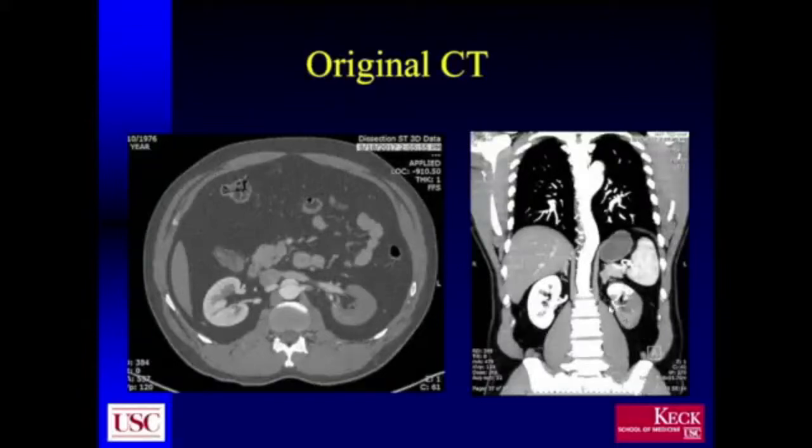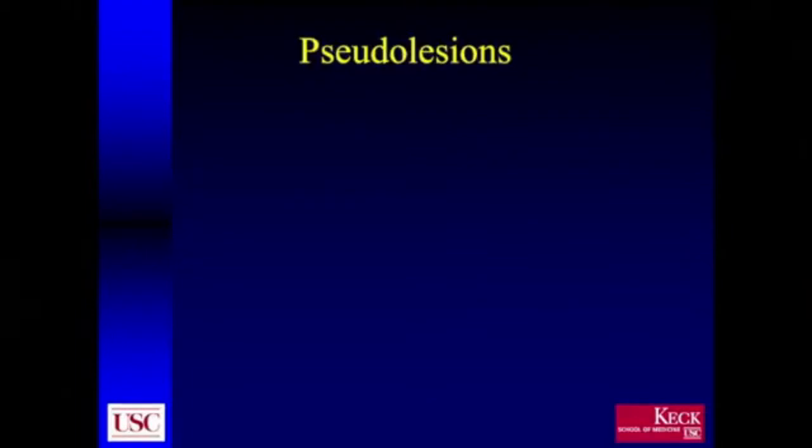This is that single vessel that you could see going to the upper pole that we showed on the recent ultrasound. So again, there are various vascular abnormalities, such as infarcts in this particular case, where contrast ultrasound may occasionally be of value for further clarification. Moving into mass-type lesions, which again represent the vast majority of things that we evaluate with contrast, I mentioned pseudolesions.